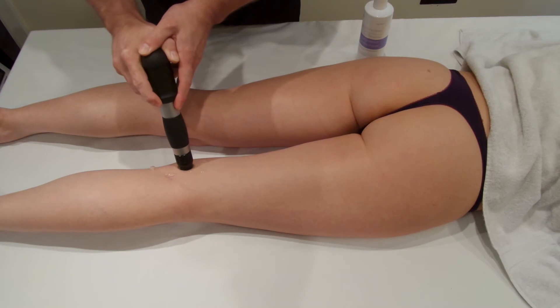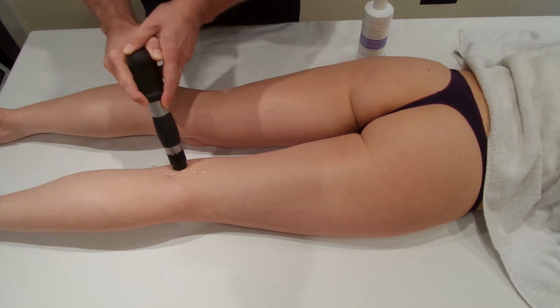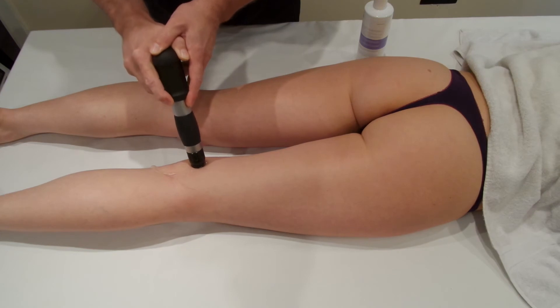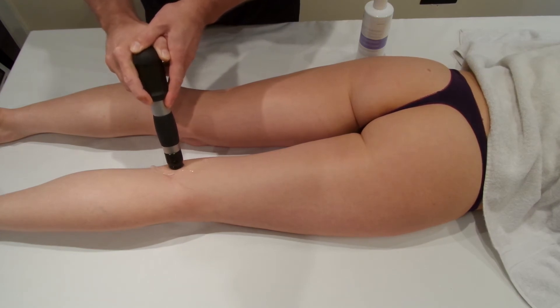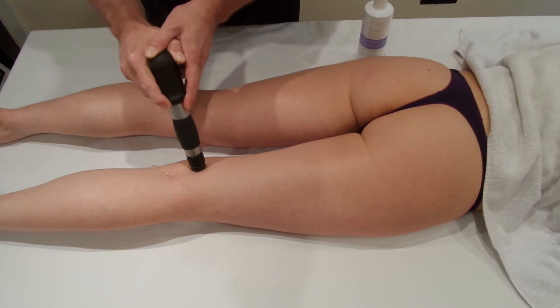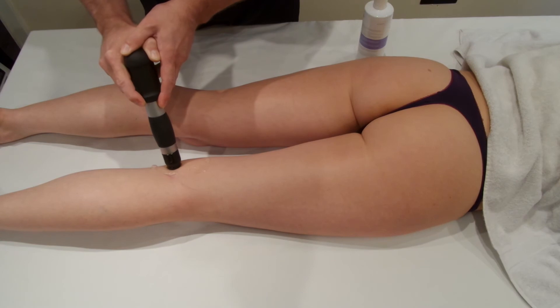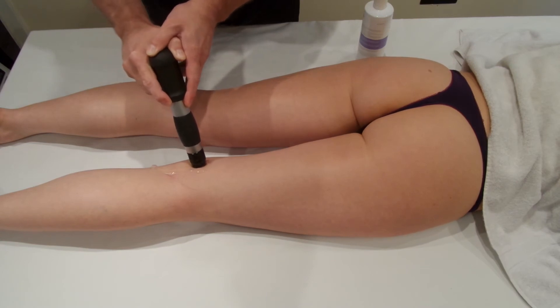You can use this technique on the upper hamstring tendon at the insertion. The video is the same, actually, as doing the insertional tendonitis, so please watch that video if you want to see how this is done at the opposite end.